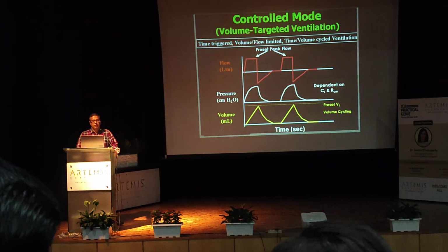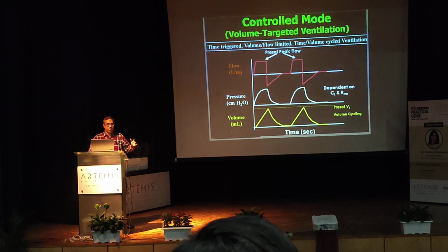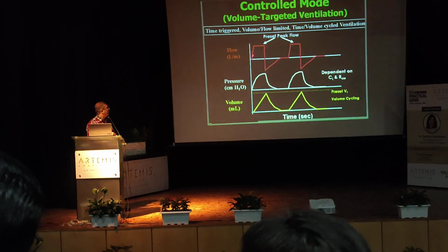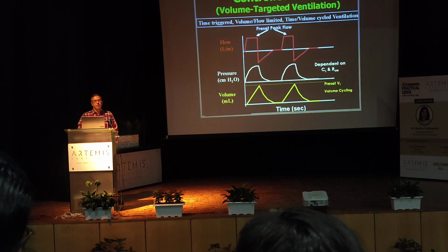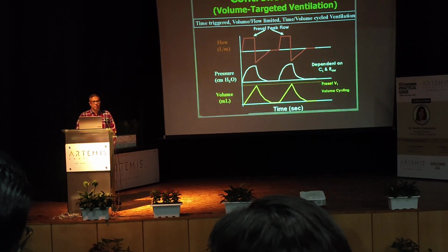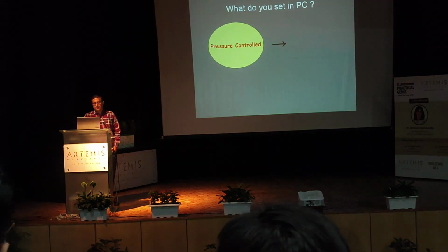And this is how all the three scalars look in a controlled mode. You can be given a scalar and asked to identify the mode. So remember, try to look for a square waveform. If the flow is a square waveform, this is a volume controlled mode. Look for any dips to see whether it is patient triggered or time triggered. Anyone? Time triggered. Why? No negative deflection. Very good.